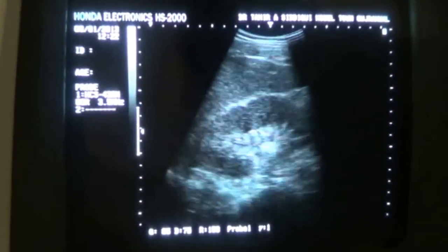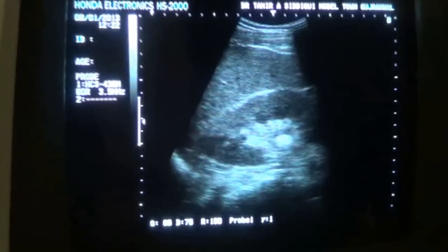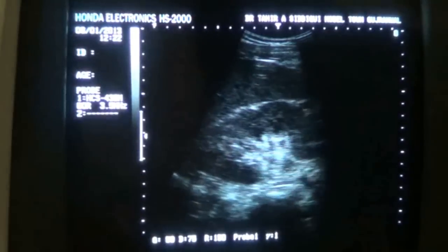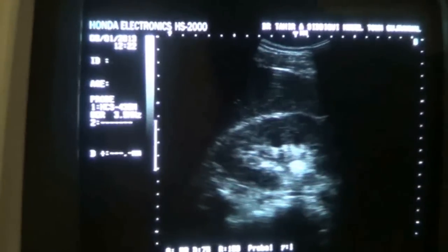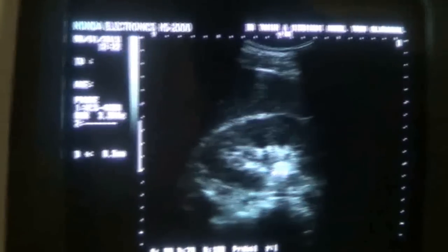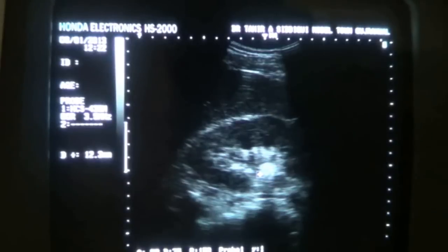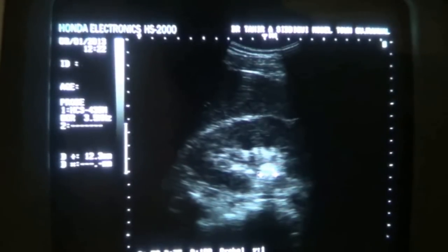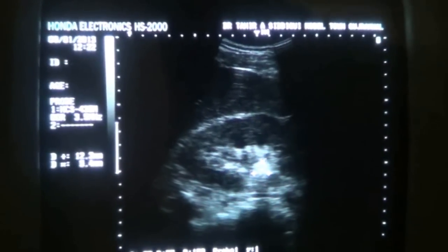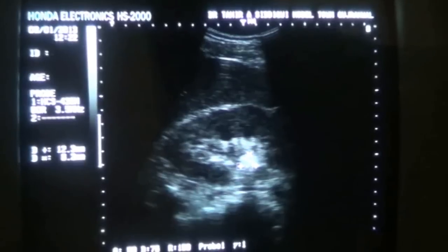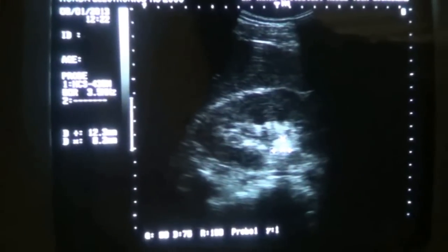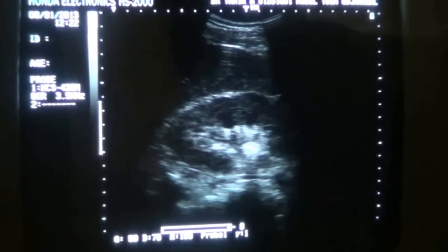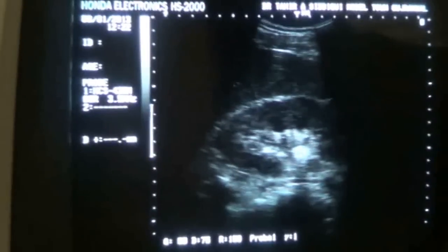In this kidney we see a dense echogenic area with sharp posterior shadowing. This area measures approximately 12.2 x 8.2 mm and is in the renal pelvis.